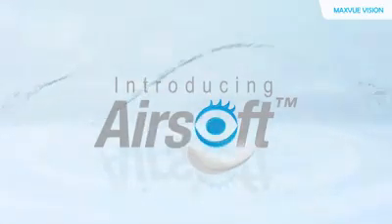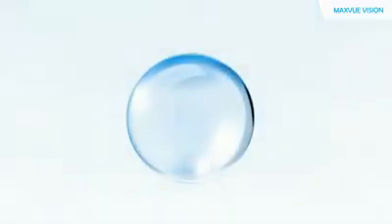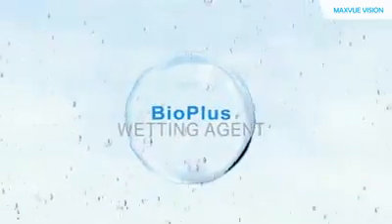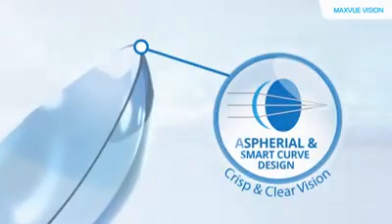Introducing Airsoft Silicone Hydrogel Contact Lenses. Gives you lasting surface moisture. Contains Bio Plus Wetting Agent for excellent initial comfort. Aspherical and smart curve design for crisp and clear vision.